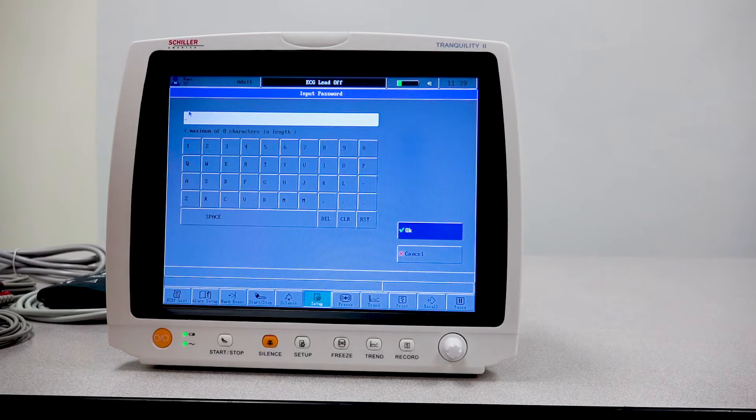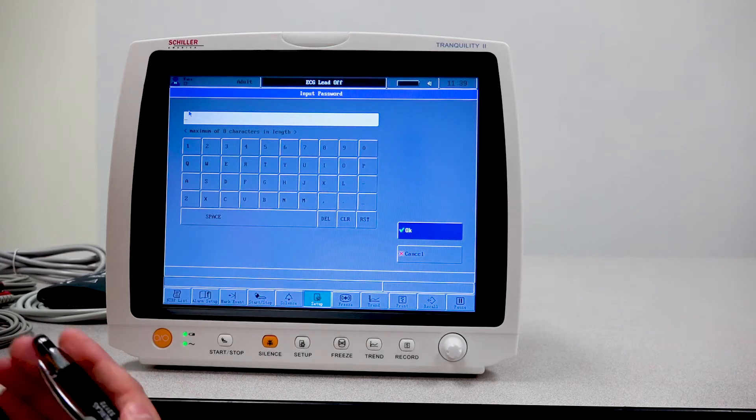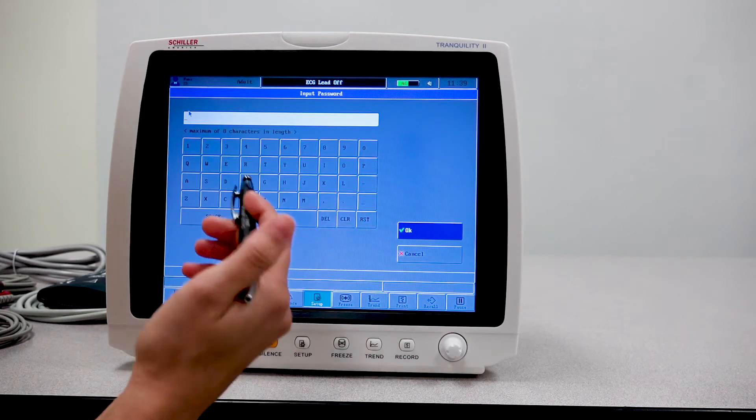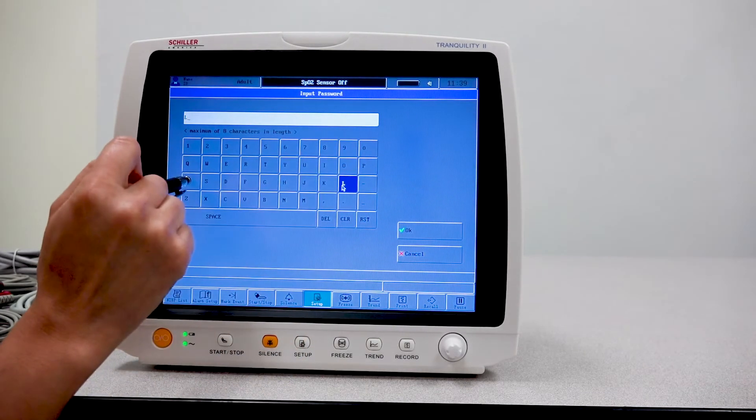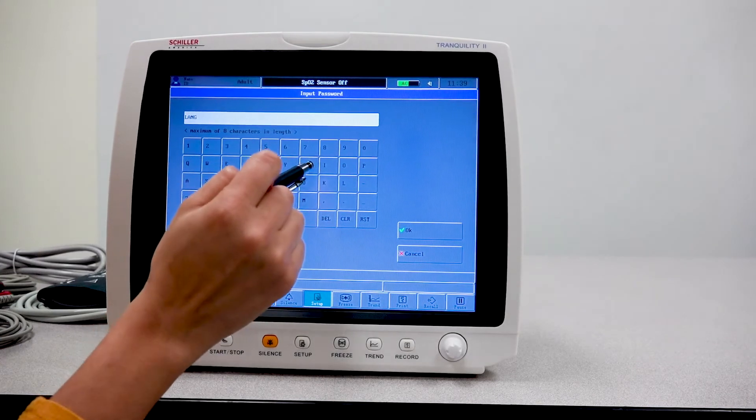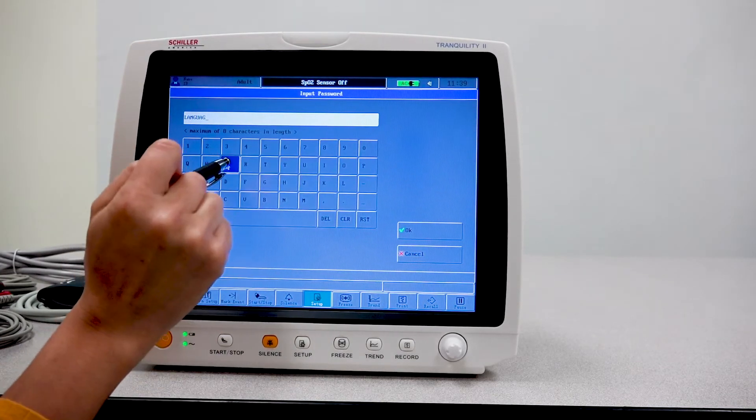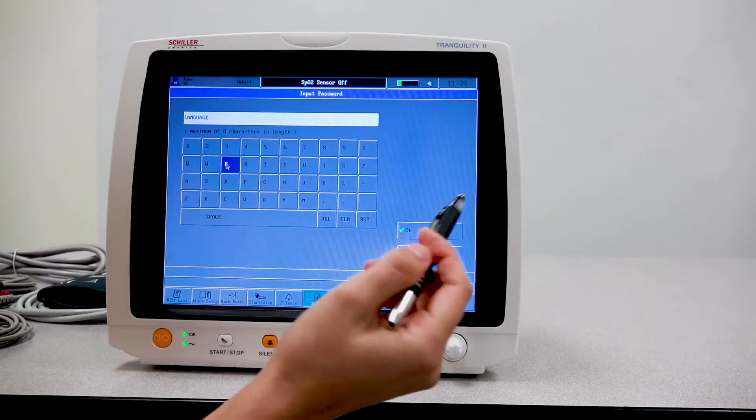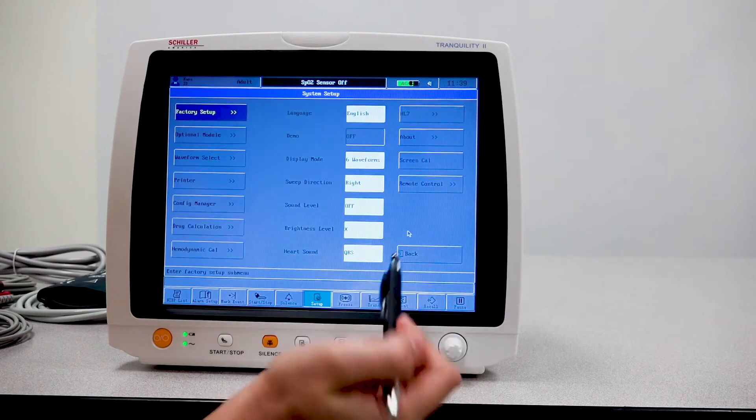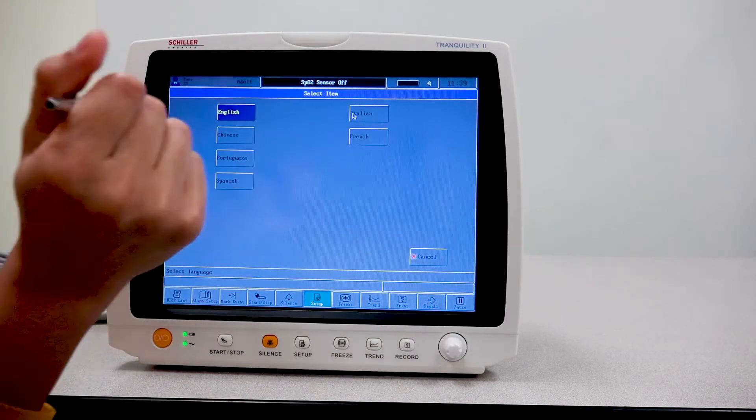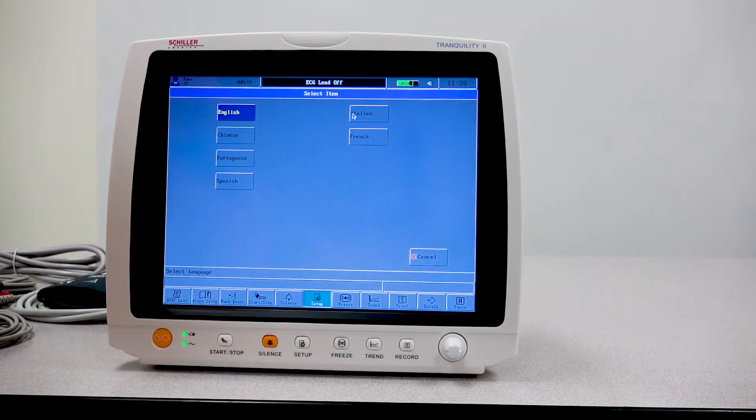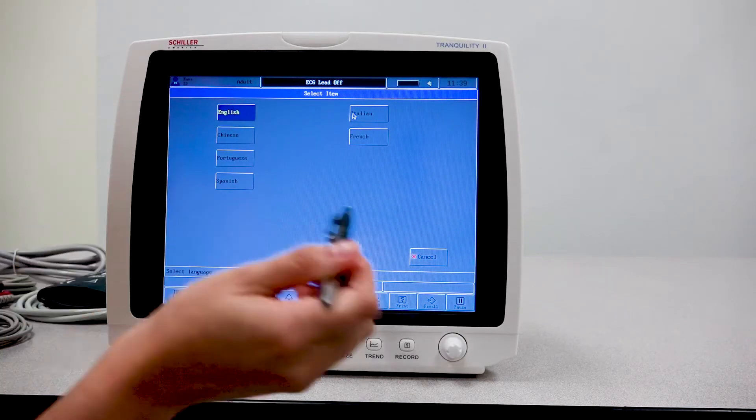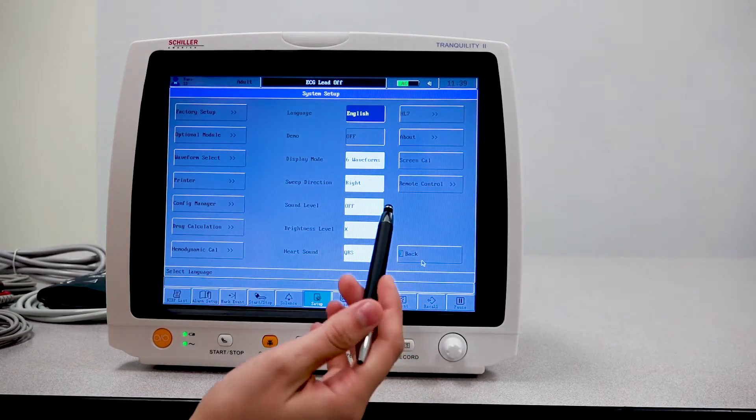In order to change these settings, you do need a password. So be sure to be entering the correct password. For language, the password is language. Once I've entered it correctly, I'll go ahead and press OK. Now I have the option here to change the language of the unit. I want to leave it at English, so we're just going to press cancel.